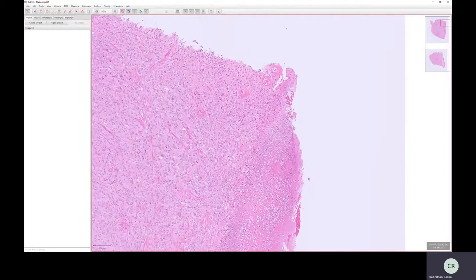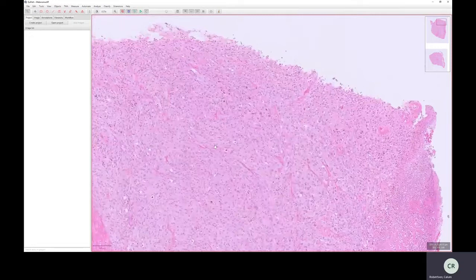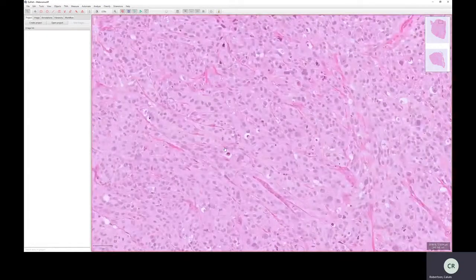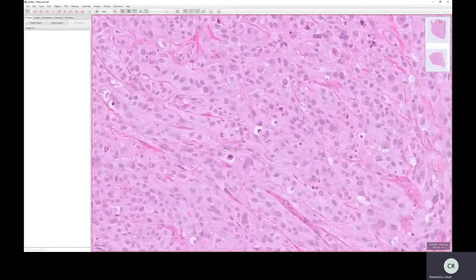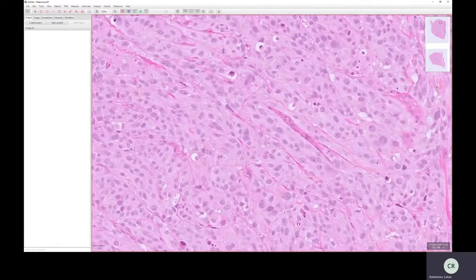The other thing is this is pathological, but this is a good way of showing something that happens pathologically, but also physiologically. So obviously cells are living, they only have a certain lifespan. And within that lifespan, it starts with a cell dividing through mitosis, and it ends with them dying through programmed cell death or apoptosis. This has accelerated that process here because this is a melanoma. These cells are replicating far too quickly. What it does mean is we can show some good examples of mitosis.